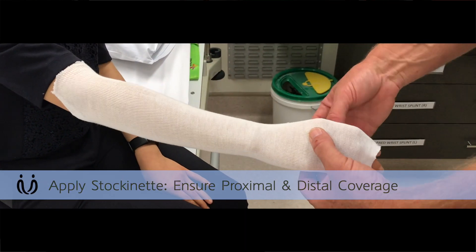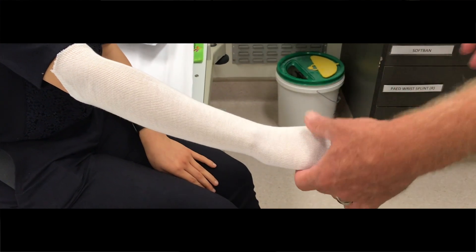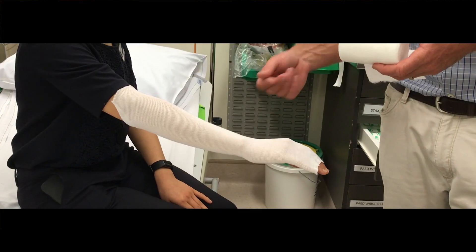Plaster on skin — it's exothermic, isn't it? As the plaster hardens it produces heat, so you don't want to give them a burn or anything. That's why we cover them, to make it comfortable.